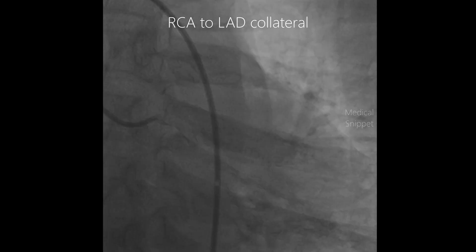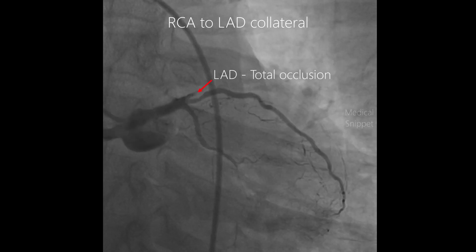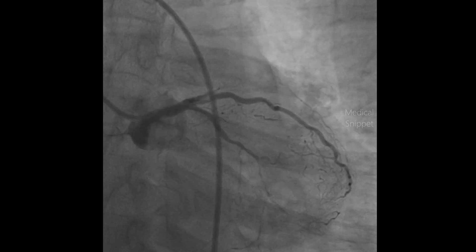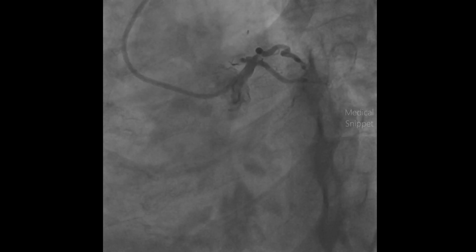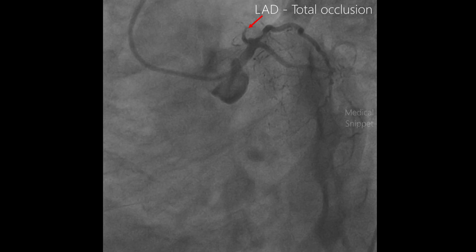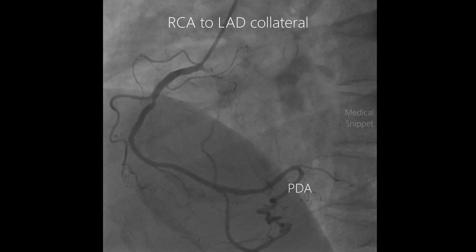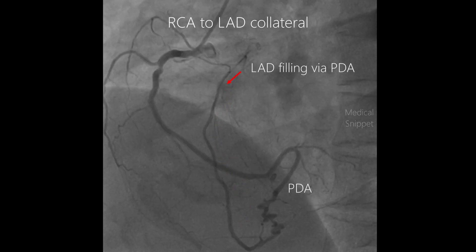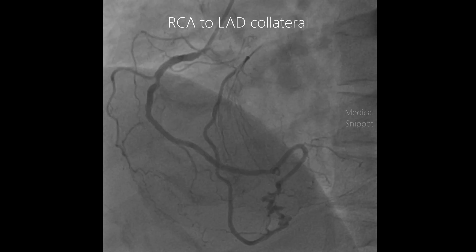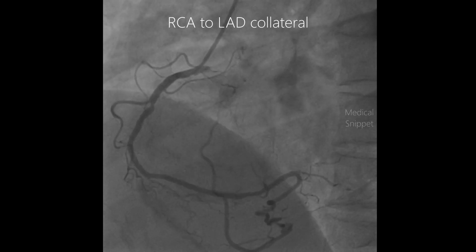Let's see coronary collaterals in angiograms. In the first case, we see collaterals from the right coronary artery to the left anterior descending artery. One can see there is total occlusion of the LAD. In this angio shot, the LAD is being filled from the PDA — that is, the posterior descending artery — which is a branch of the right coronary artery.